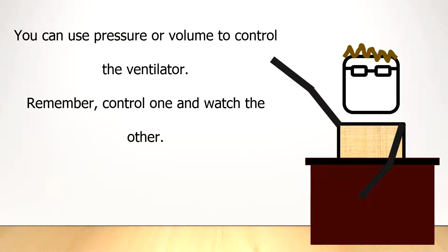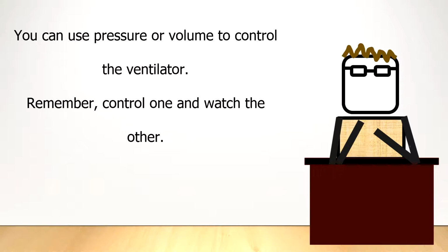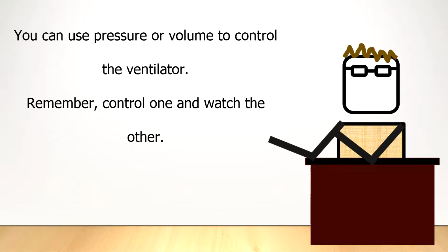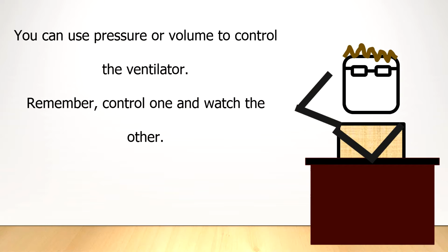There is in reality no evidence of benefit for controlling the ventilator's volume or pressure as its primary mode of ventilation, but you should know that when you control one of those two variables, the other one becomes the issue that you need to watch. So when you're on a volume control mode of ventilation, you set the volume, but you need to watch your airway pressures. Conversely, if you are on a pressure control mode, you set the pressure that you want the lungs to have, but you have to watch what tidal volume is being delivered.